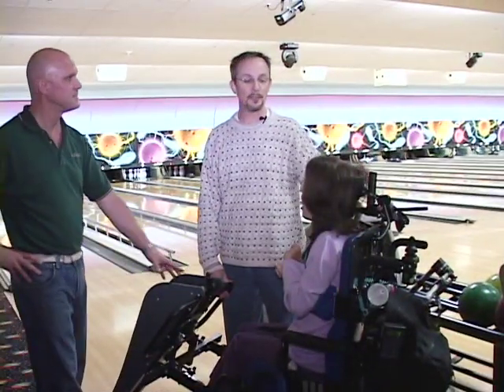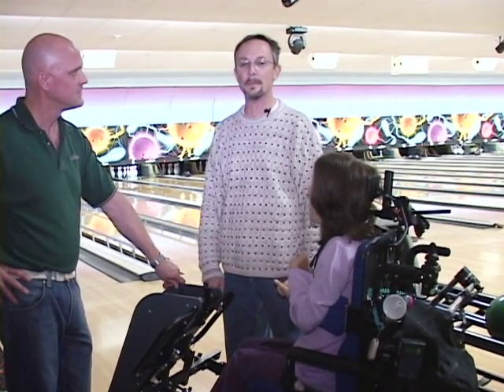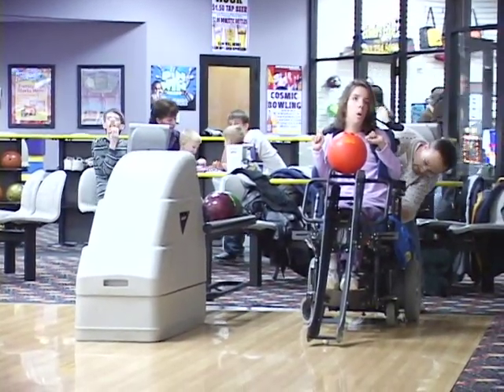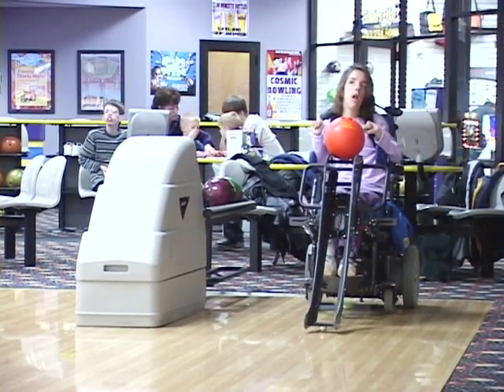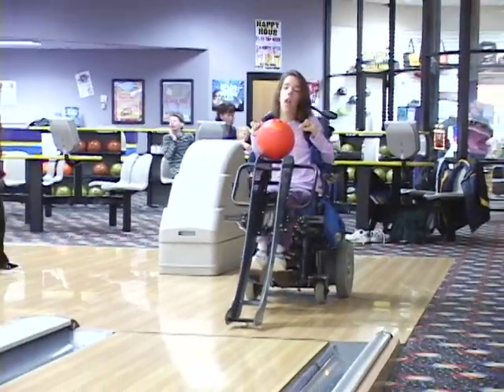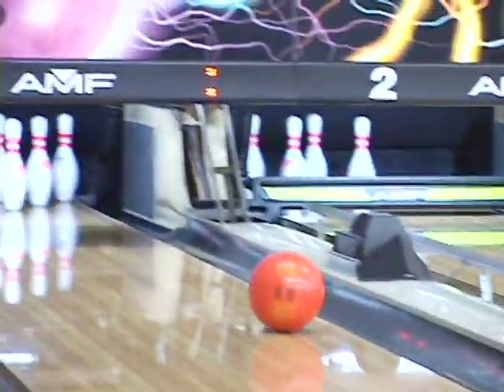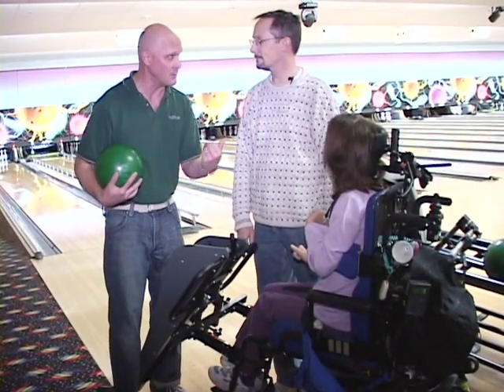She drives her power chair with her head, and when she takes the chair down the lanes towards the pin, the momentum of the ball going, when the chair stops, takes the ball down the ramp and towards the pins. So, let's kind of get a look at it. Actually, the ball sits up here, she'll move the chair, and then when she stops the chair, it'll rip down the chute and down the lane, and so she can actually kind of angle the chair to get a guided shot.